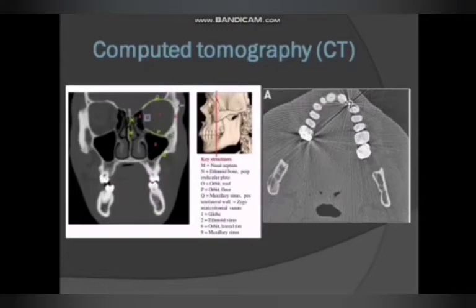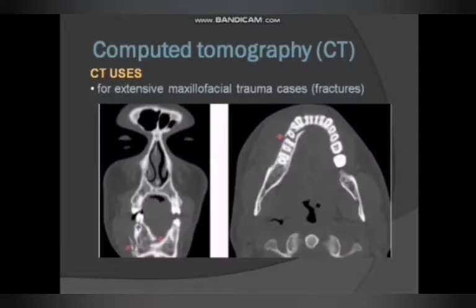CT has an advantage over other radiographic techniques. It allows visualization of high contrast resolution and tissue structure. However, the examination is expensive and may give very high radiation doses to the patients. And also, a marked artifact may be produced by metallic objects like stainless steel crown and filling. So, with these disadvantages of computed tomography, its uses should be justified based on clinical information.